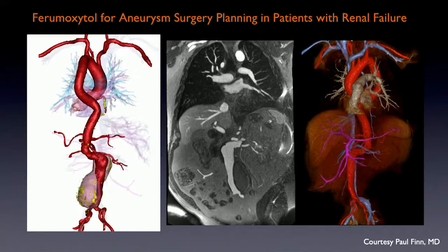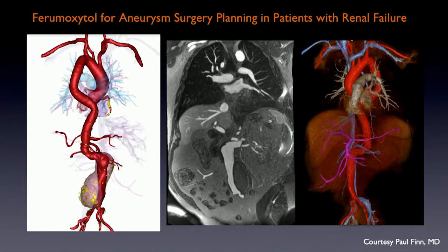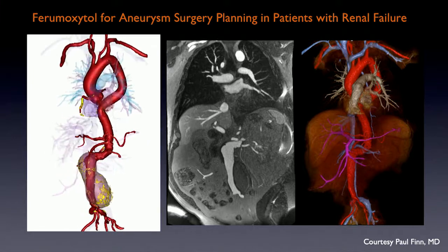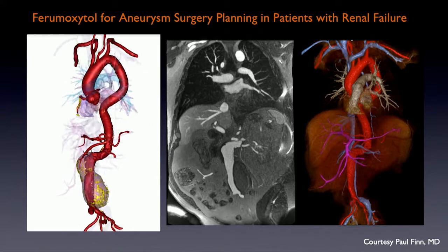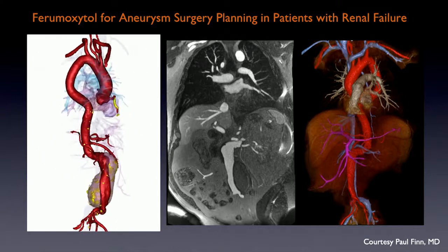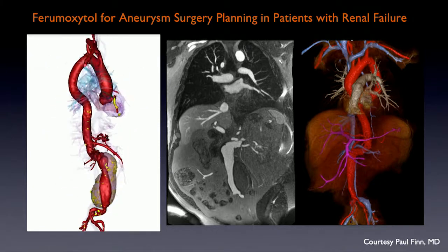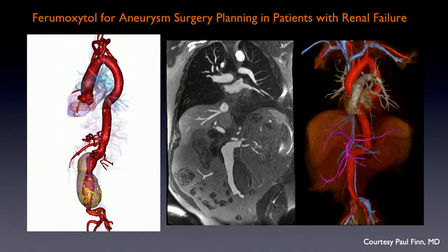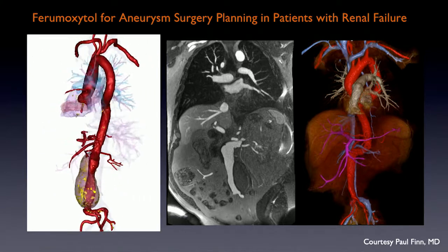It's also extremely useful for aneurysm surgery planning as well. So you can size the entire aneurysm sac, evaluate how much thrombus there is, see the bifurcation, assess the relationship of the neck to the renal arteries, and do all the same measurements you could for an endovascular aneurysm repair, just like you could evaluate the iliacs for sizing prior to placement of your sheath for TAVI.